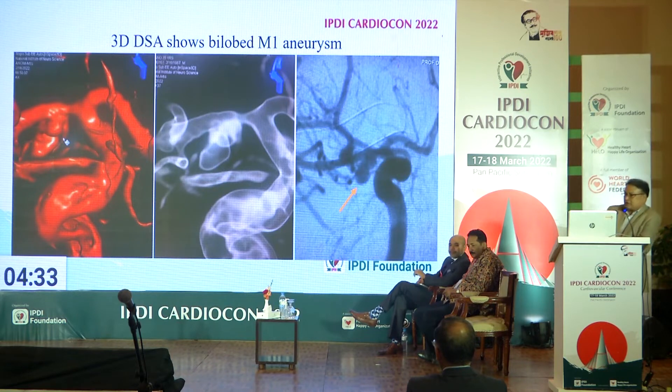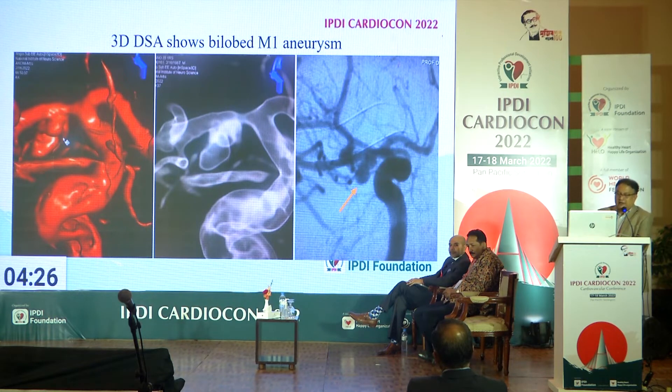On vascular imaging, you can easily see there is an aneurysmal dilatation in the middle cerebral artery. Whenever we perform DSA, we can easily detect this kind of aneurysm. We then plan for surgical or neurointerventional treatment. We do a 3D angiogram of the brain vessels and clearly characterize it. We measure the aneurysm by its size, shape, and collateral vessels. You can see here we are passing our microcatheters, and through the catheter we are filling the coil into the aneurysmal sac. Our target is to occlude the aneurysmal sac from total circulation so that it doesn't rupture and doesn't create any problem inside the brain.